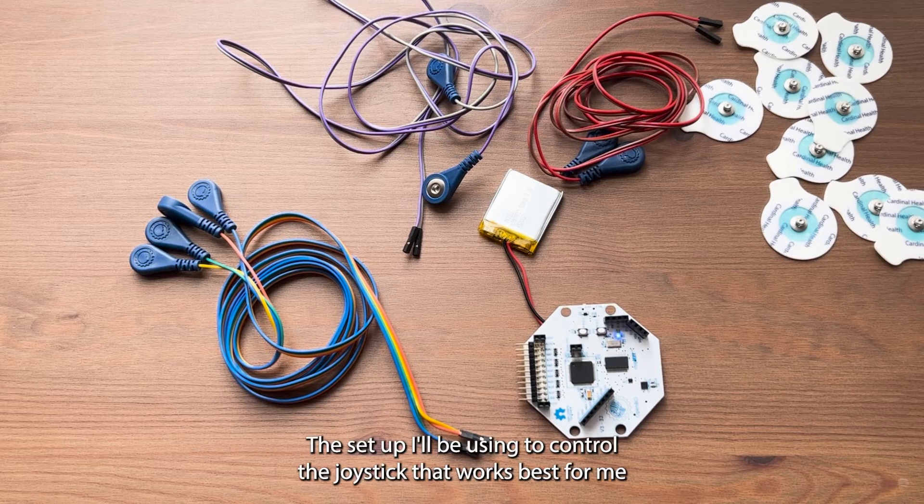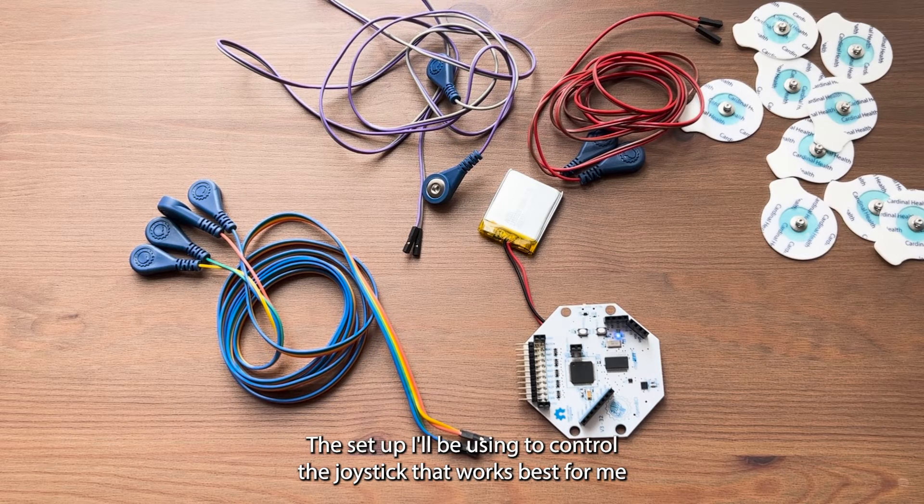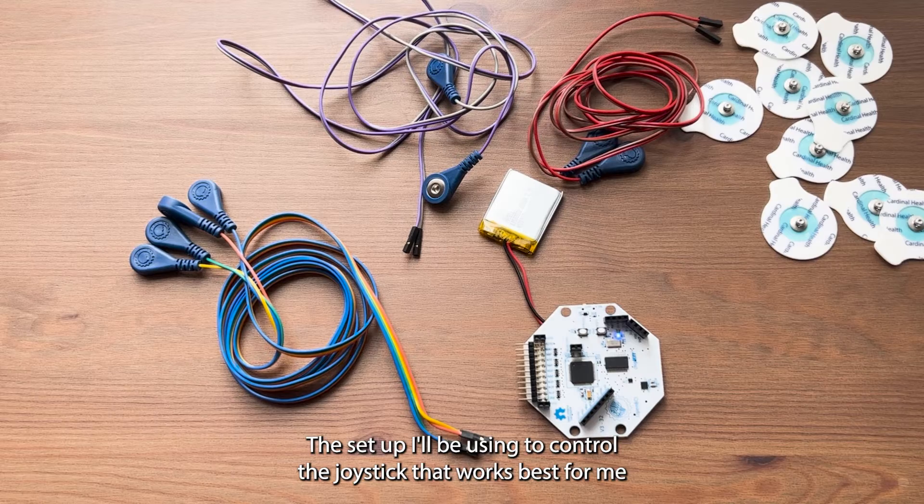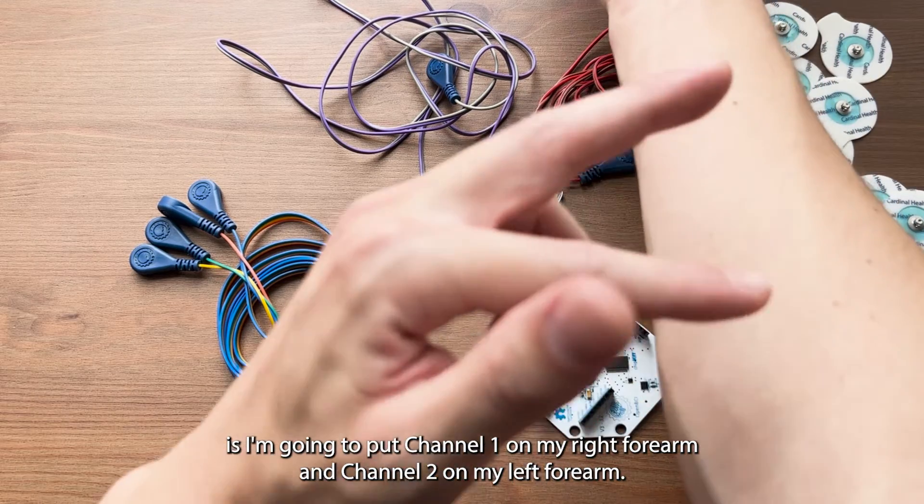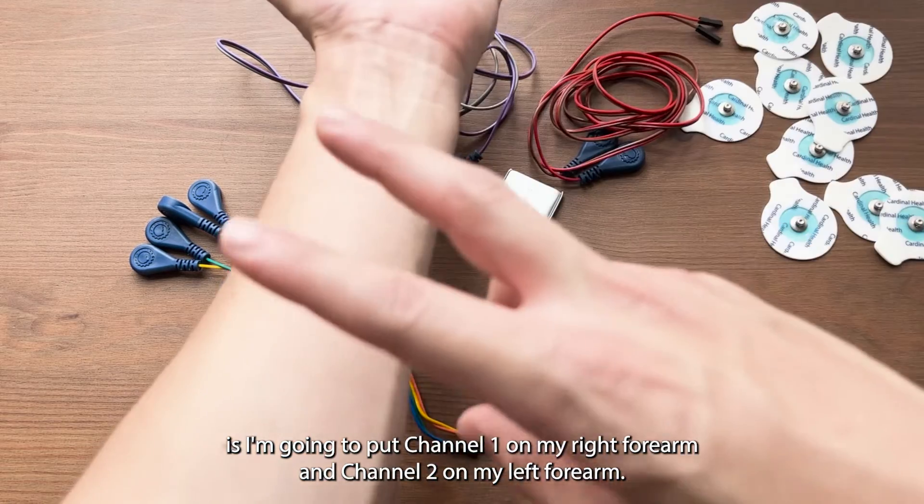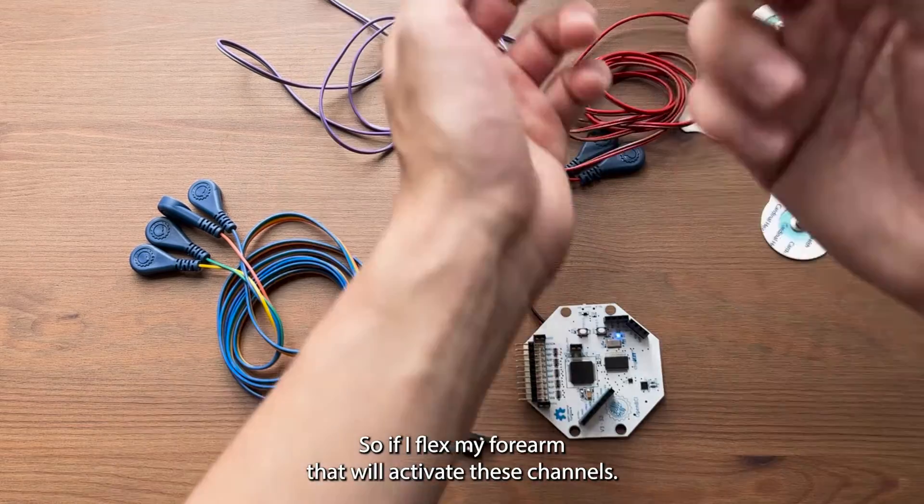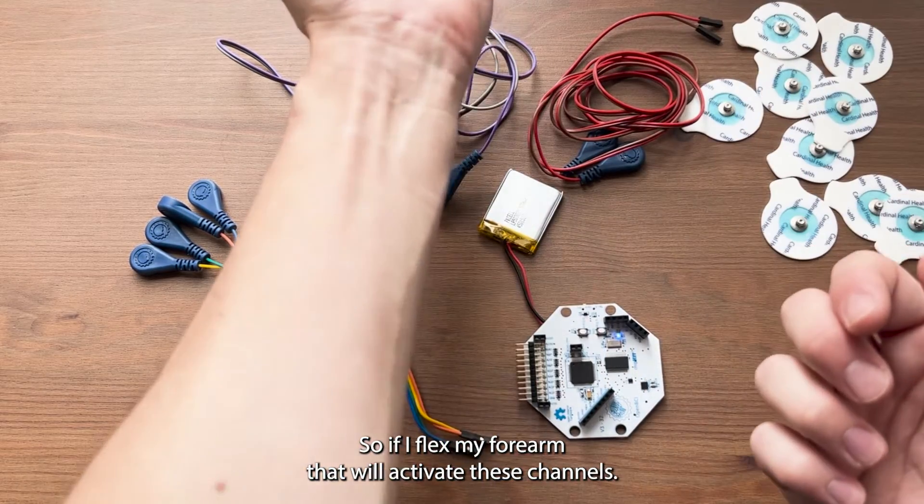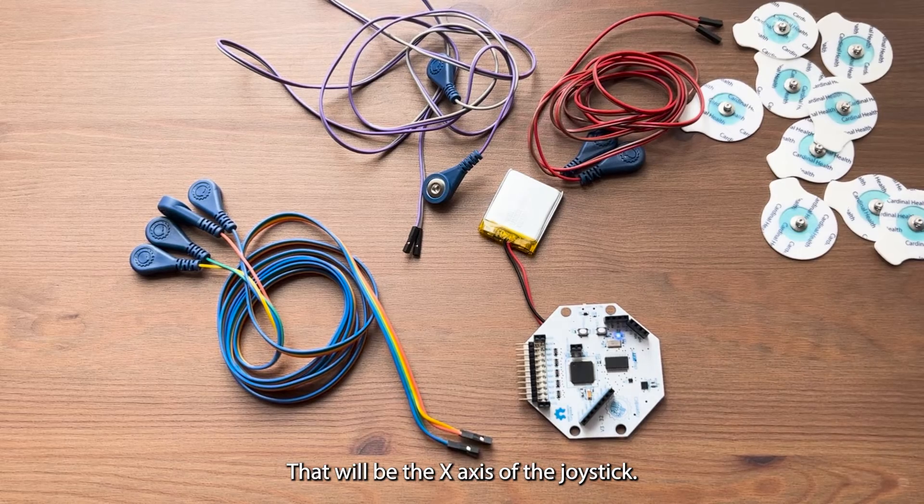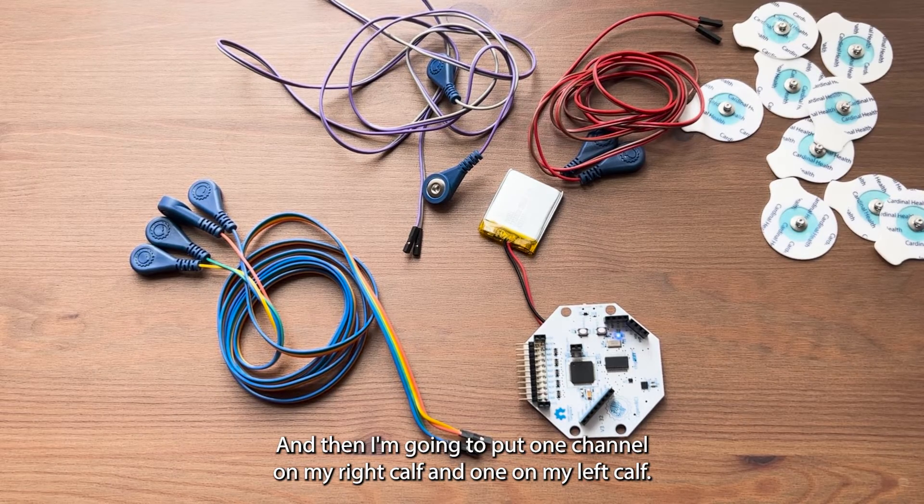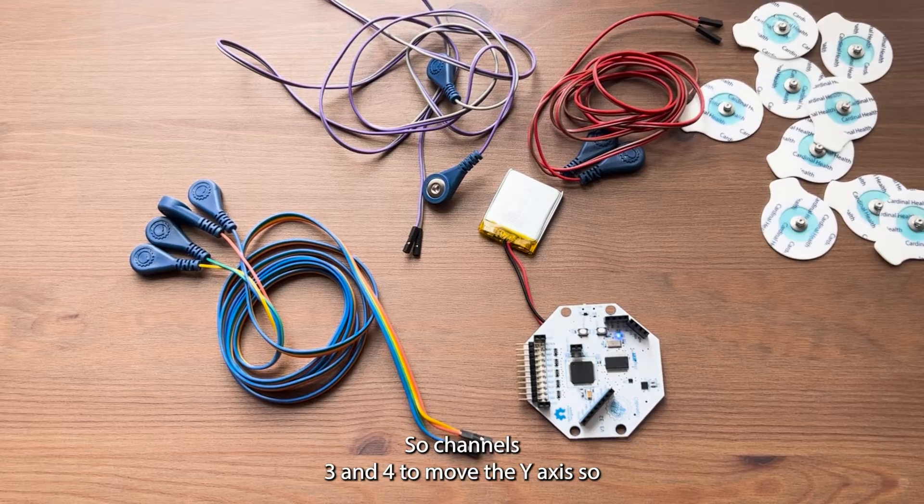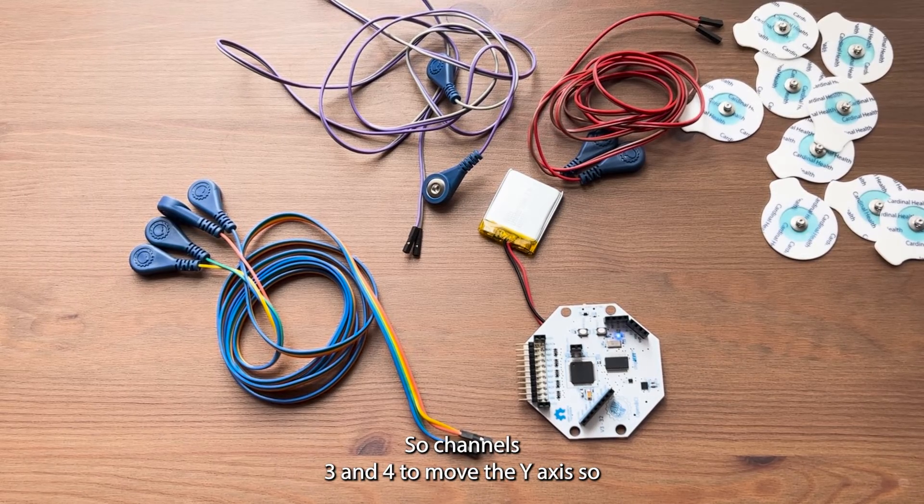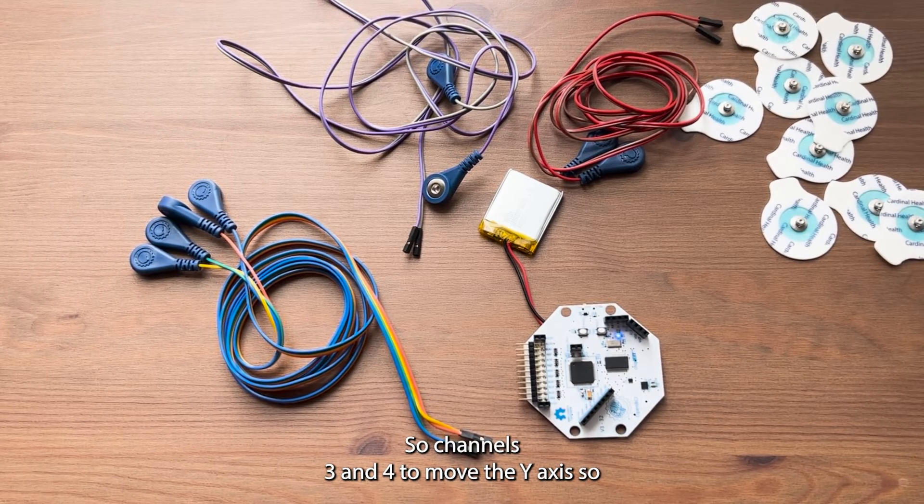The setup I'll be using to control the joystick that works best for me is I'm going to put channel one on my right forearm and channel two on my left forearm. If I flex my forearm that will activate these channels, that will be the x-axis of the joystick. And then I'm going to put one channel on my right calf and one on my left calf. So channels three and four to move the y-axis.